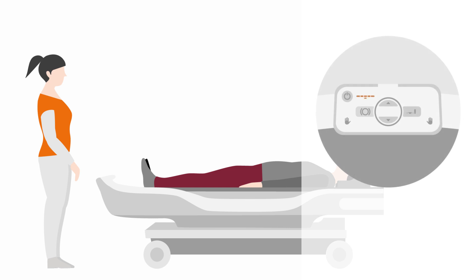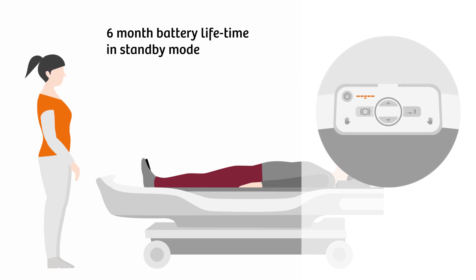The table's battery lasts up to six months in standby mode and is charged automatically when the table is docked to the scanner.